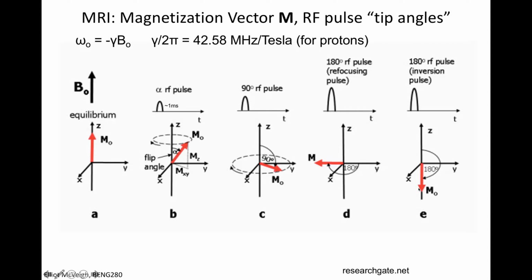So this magnetization will just slowly go back to its equilibrium value, without giving off any signal. And if you made an image at some delay after producing this pulse, so you delay until the magnetization is right at 0, whatever tissue has the magnetization at 0 will turn up with 0 signal. It'll just be black in the image.